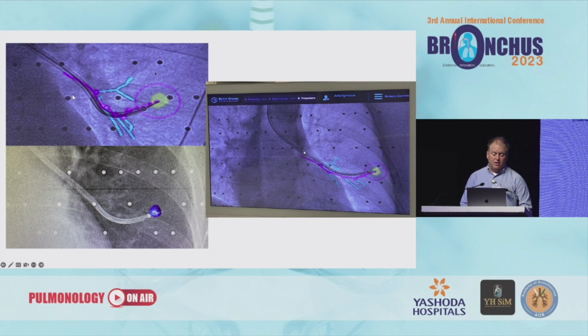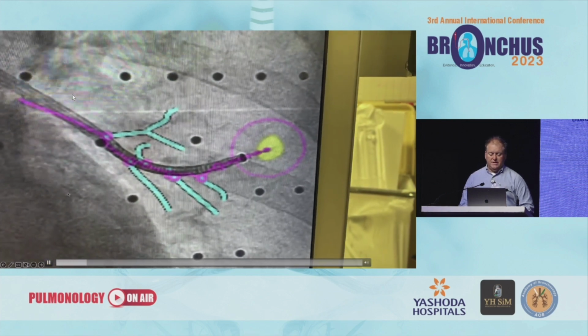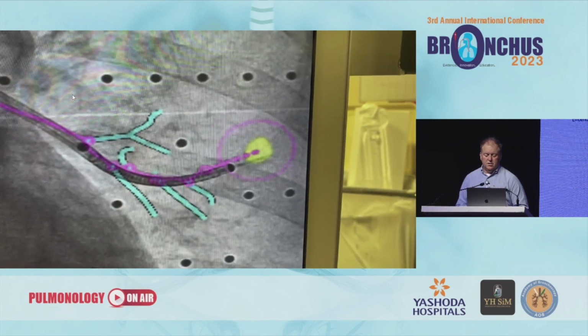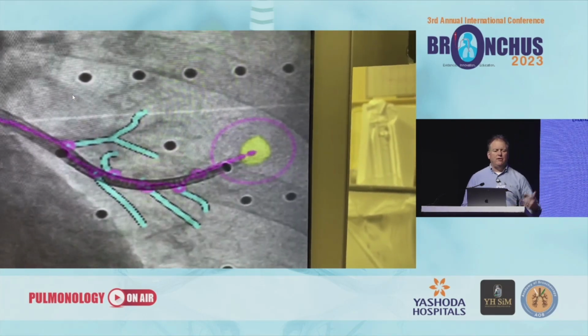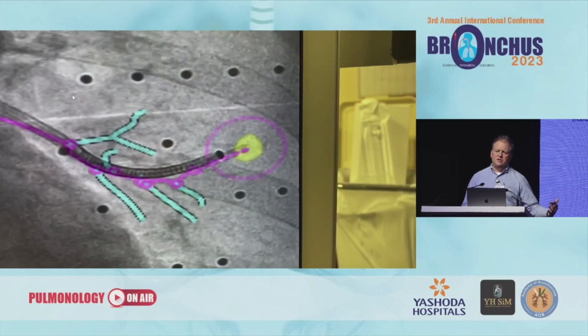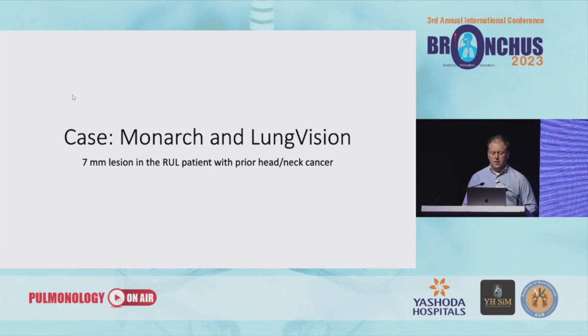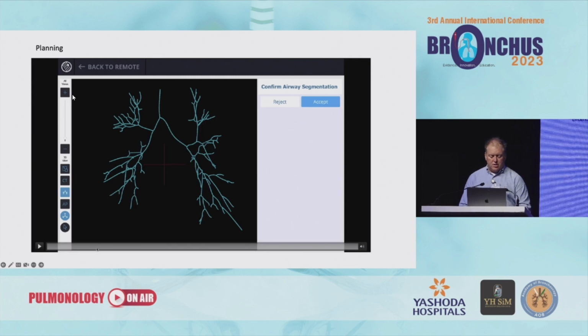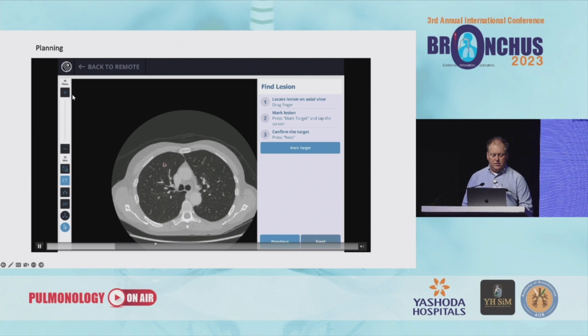They're beautiful images, and of course, we'll notice the definite similarities. And then, similarly, as Mike's taking his biopsies, he's able to have confirmation that his needle is exactly where it should be, because that is confirmed in real time, about 30 seconds before he did his biopsies, where the lesion is located.